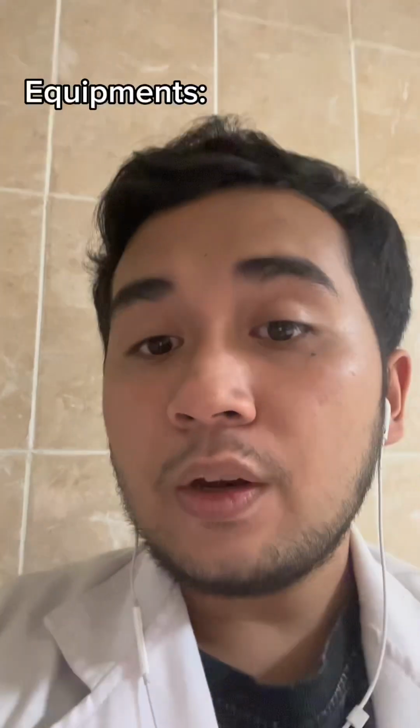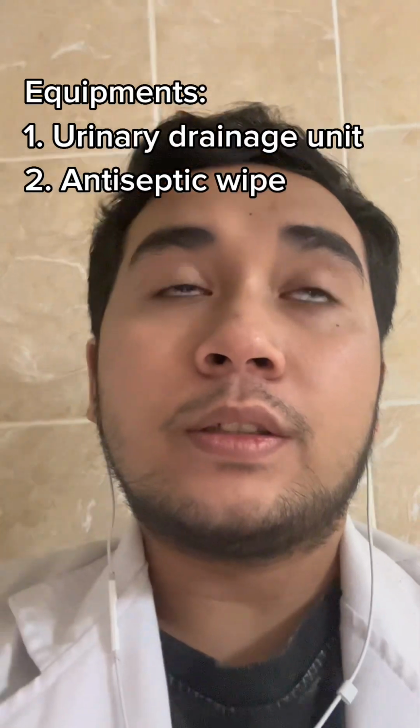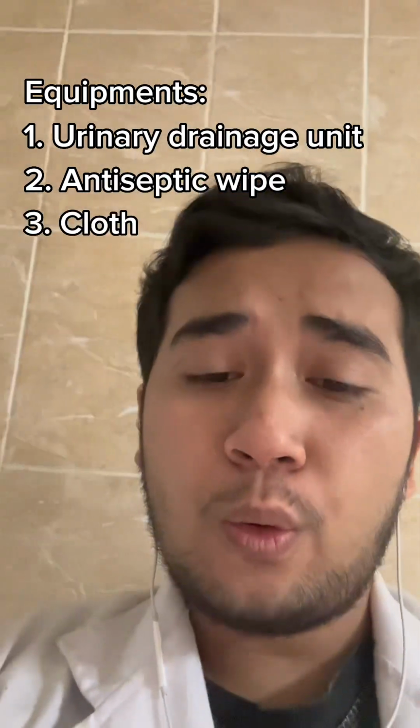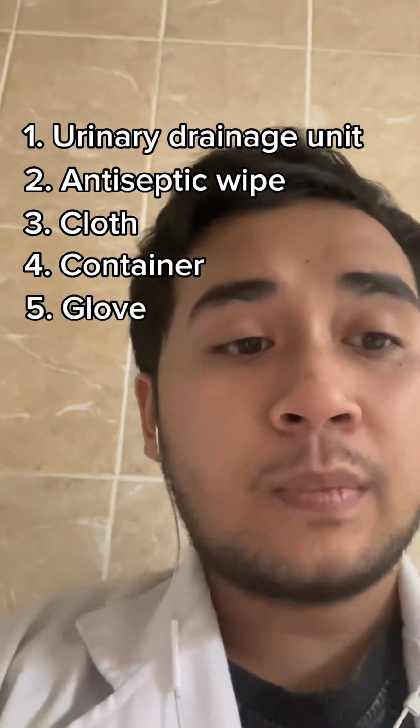So, the equipment we need: a urinary drainage unit, of course, an antiseptic wipe, a cloth, a container to put the urine in, and gloves, of course.